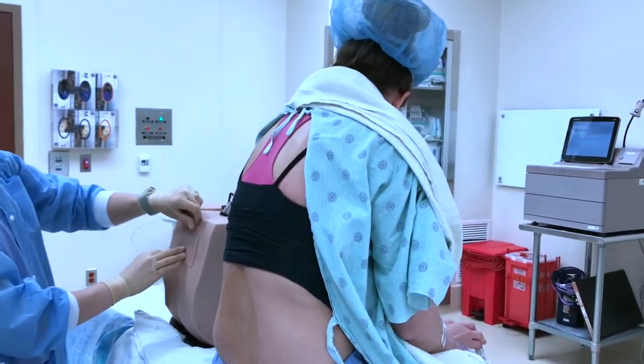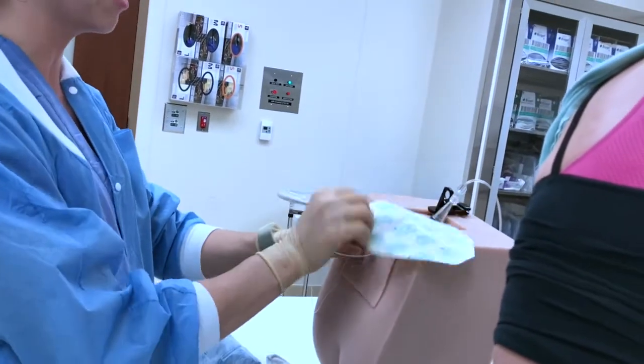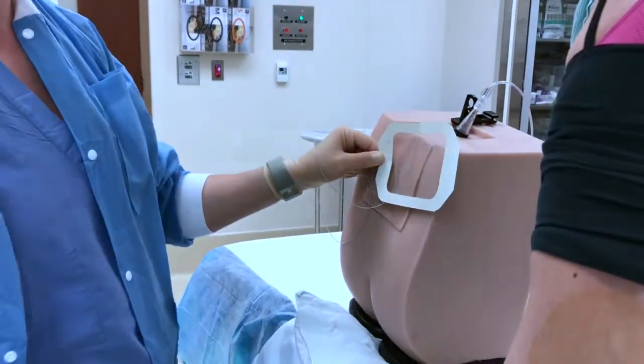The next thing we'll do is take off the drape, and once the drape is off, we will secure our Tegaderm and our catheter. Some people like to put a little loop in before you secure it. That just helps keep it in place in case they should move around any.